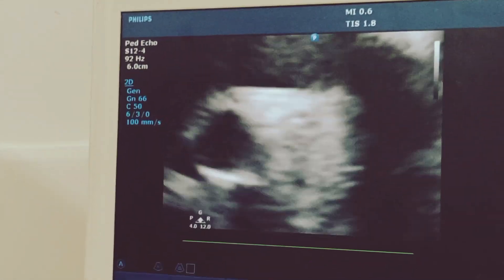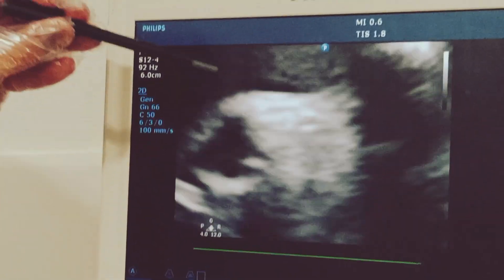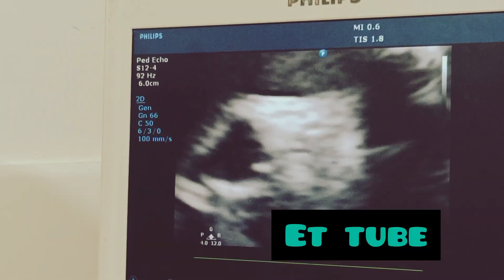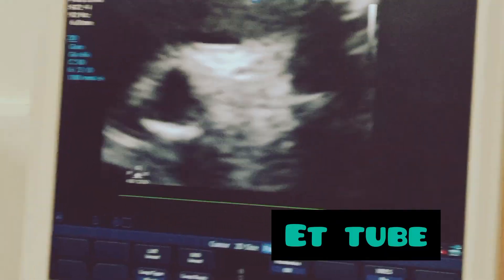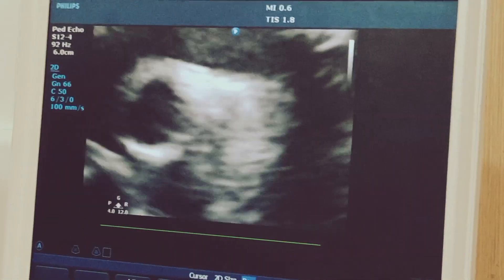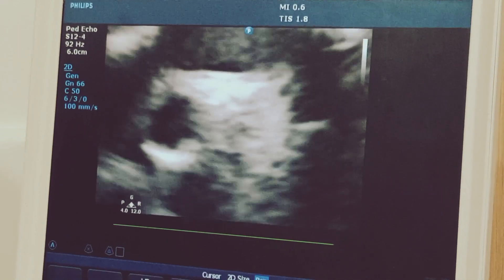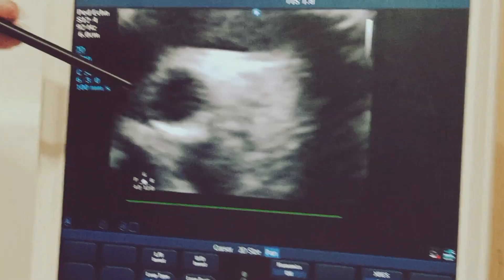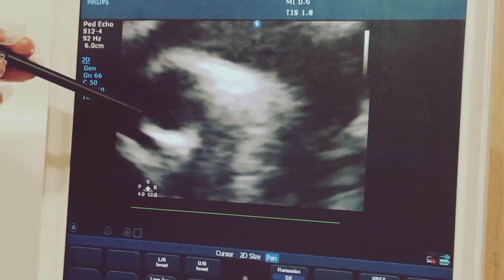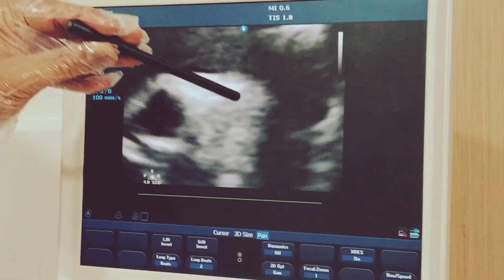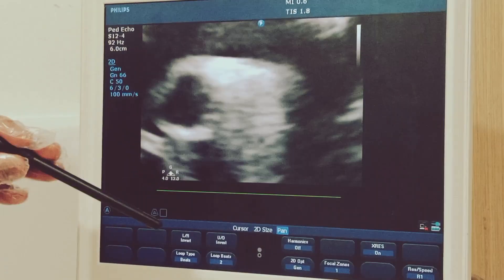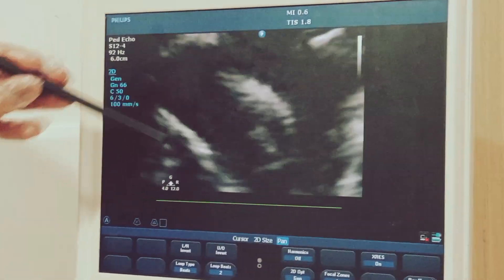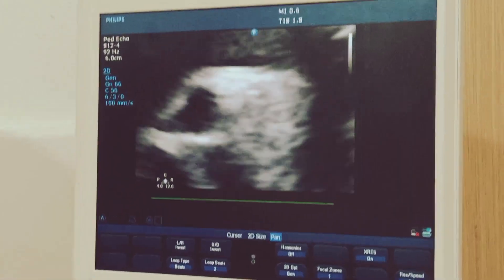I will zoom it so you can see the endotracheal tube there. You can see the movement happening. It is always better to keep it just about 0.5 centimeters above the right pulmonary artery.